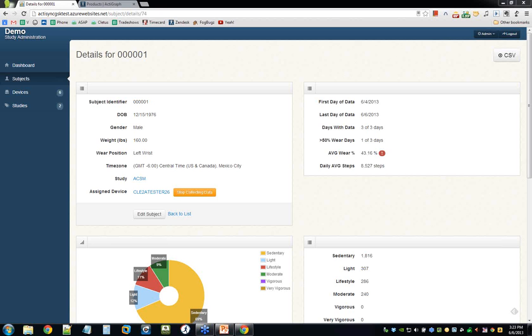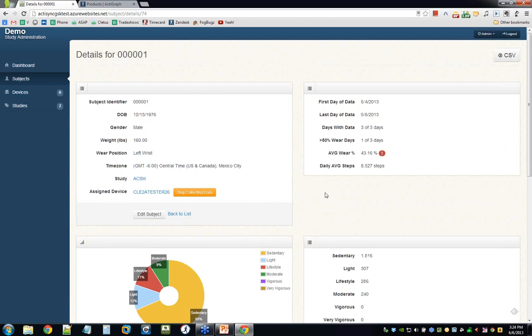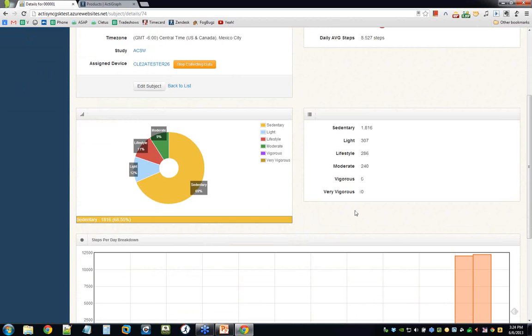Okay, a question from Madeline. The portal is asking, does it allow for storing the raw outputs from the device? It provides the outputs we pre-configured. So today, Madeline, in the state that this system is in, what you would see in the system would be what you work with us to configure. If you're interested in looking at cut points, then that's what we'll display. However, the source data from which that data was derived can be downloaded from the system, and you could download that data and process it by other means if you wish.